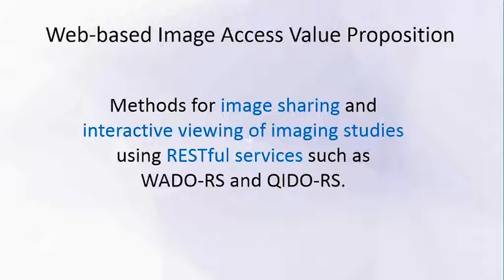The value of WIA, this profile, is to provide a method for image sharing and interactive viewing of imaging studies using the RESTful services provided by DICOM, such as WADO-RS and QIDO-RS.